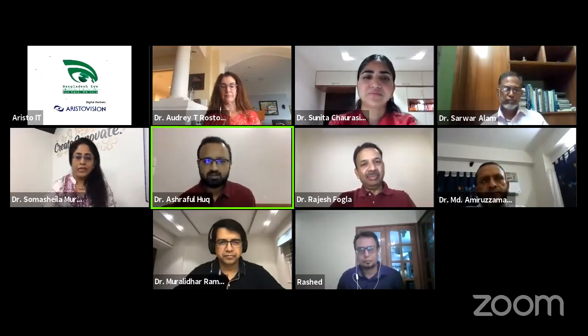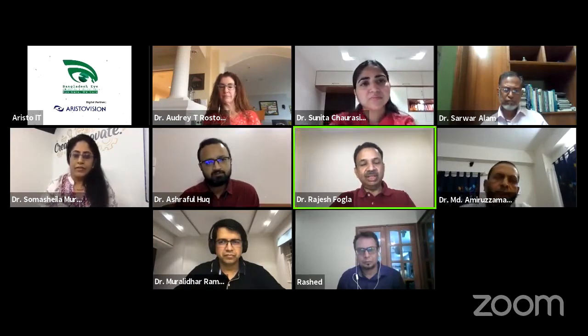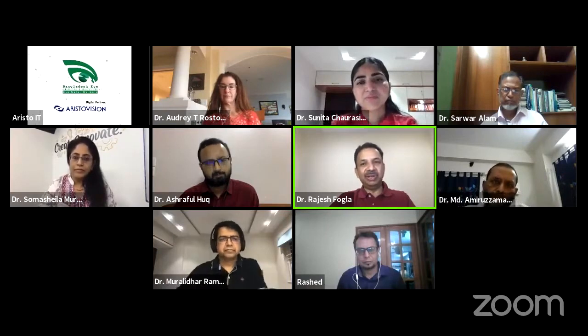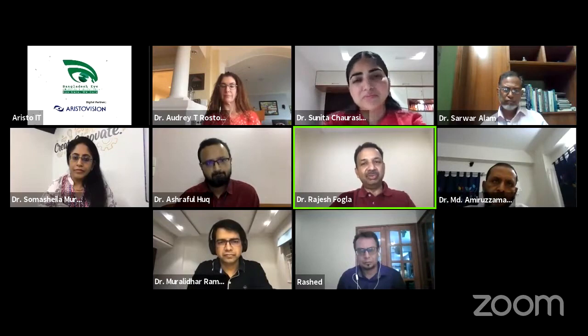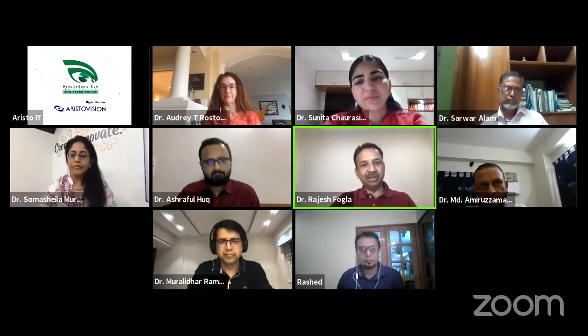Thank you, sir. And there is another question from a participant: do you prefer to remove the iris in recurrent cases of graft failure or re-PKP? No, if the iris is normal, then there is no need for removal. But if the iris is plastered to the cornea and you cannot separate it when you do your trephination, then whatever iris is plastered to the cornea, sometimes you will excise. Otherwise, you want to retain the iris because that helps keep the intraocular lens in place. If you remove a lot of iris, sometimes you'll find that the intraocular lens will start jumping out, so it won't be stable, and then you will have difficulty during the surgery.